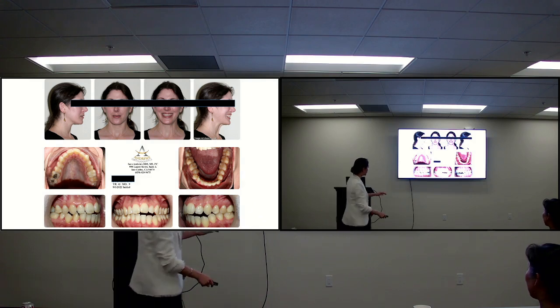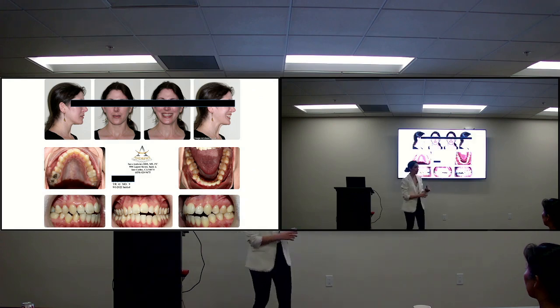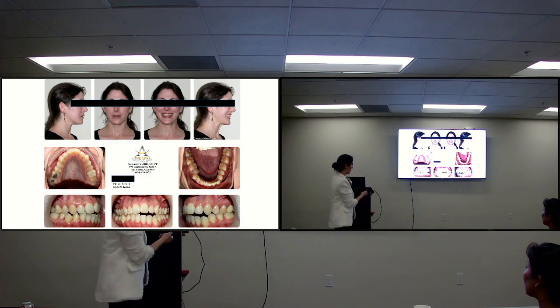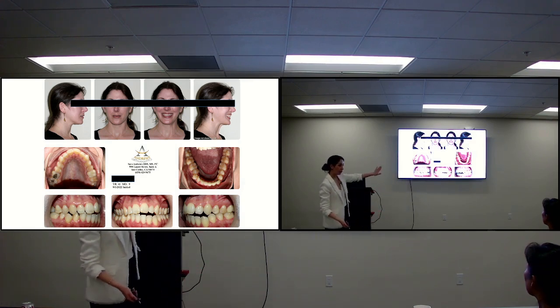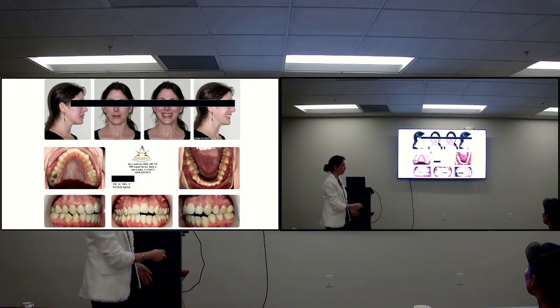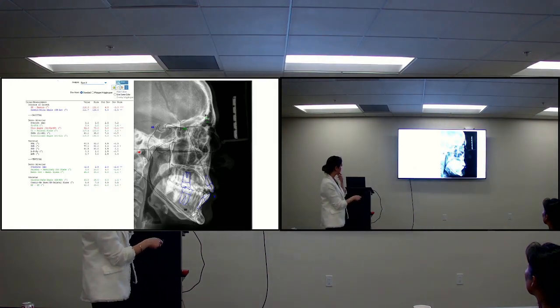So I do not want to expand these. As a matter of fact, I'm not going to move the wisdom tooth. Maybe I did, I don't know, we'll see. But anyway, I want to bring this one in. I don't want to expand the second molars. That's the widest part of the arch. I don't want to widen that anymore. So arch form is huge. And the biggest challenge in this case is that when we tuck number 28 into the arch, it's going to procline the lower anterior even more, and it's going to worsen her open bite. She's also had chin advancement surgery in the past.